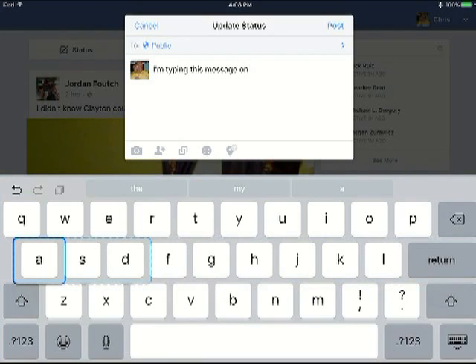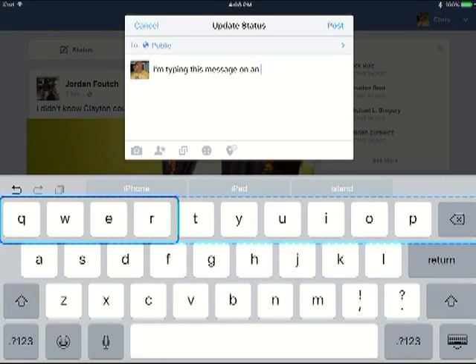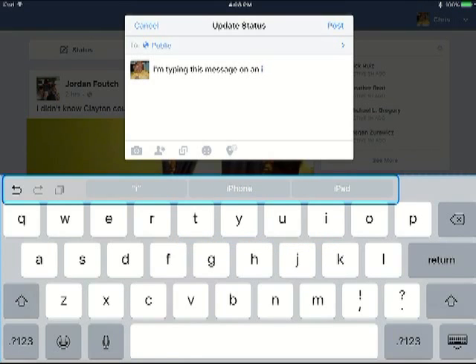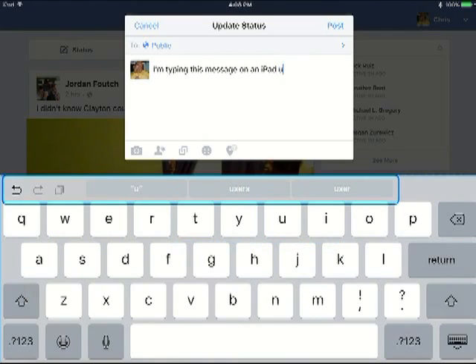If you go too far in the scanning, there's a back button. Sometimes I have to go back. For people that can't use multiple buttons, there are also single switch options that automatically scan forward, and then you use one switch to select. There are also ways you can use long presses and short presses to get various functions.